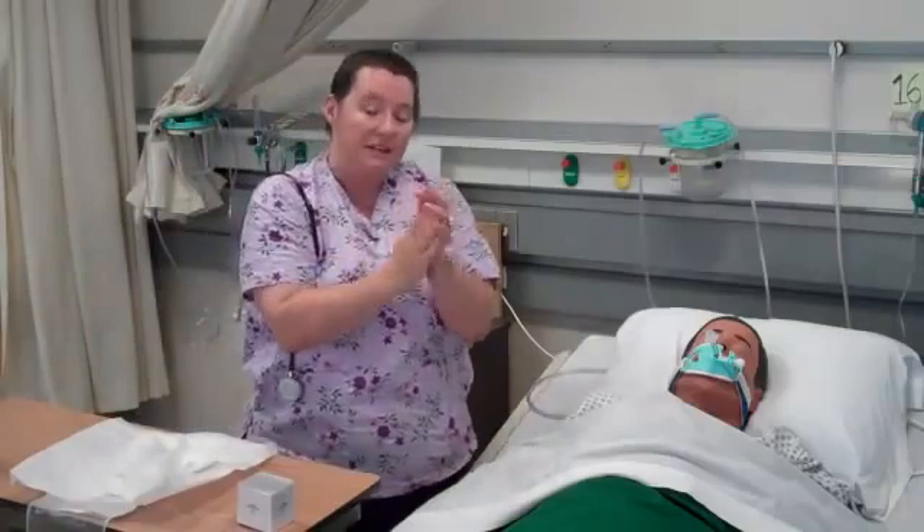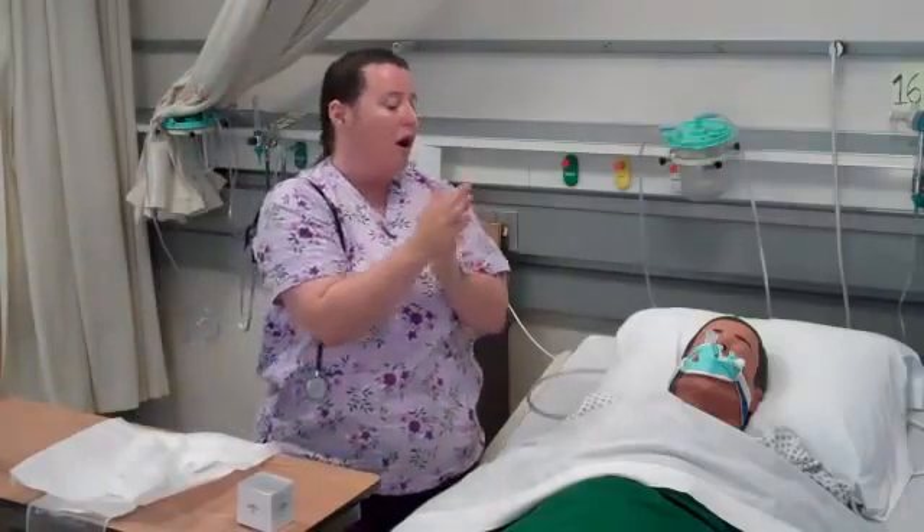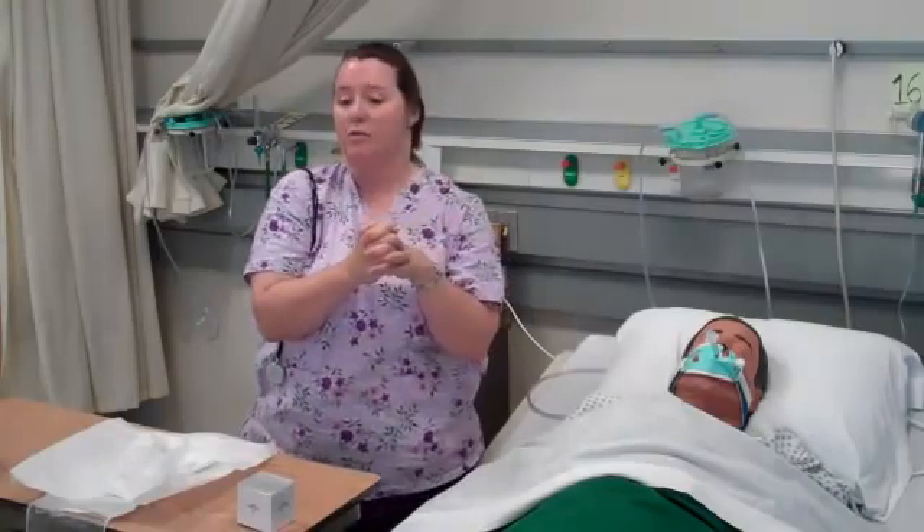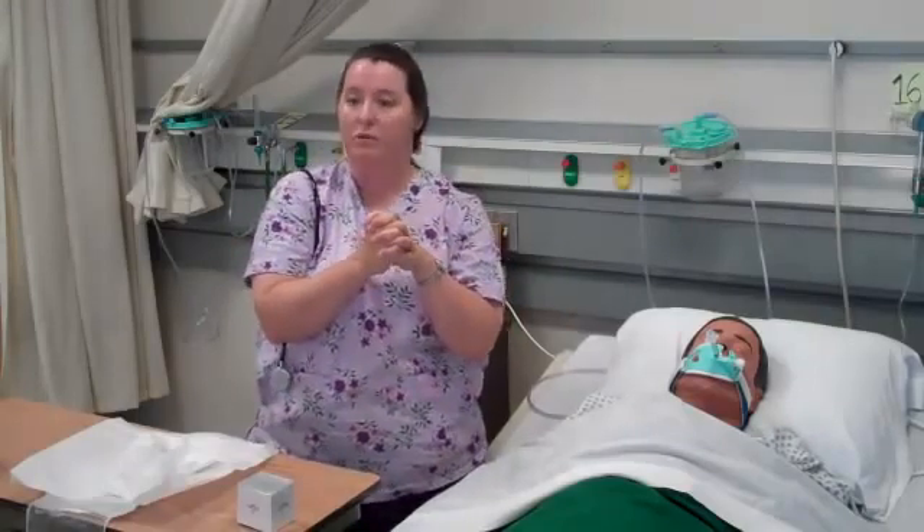After washing my hands, I reassess my patient. I auscultate for lung sounds, check his vital signs, and then document my findings and everything that was done during the procedure.